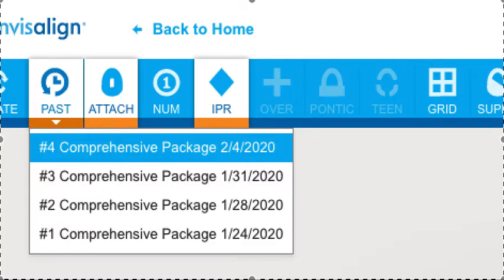Okay, so let's go back to our hypothetical 6 millimeters of crowding, 35-year-old patient. So in any case, with the class 1 canines and molars, you're probably going to have 3 options. Anyone, for me, that is, let's say, 15. This case at age 15 probably doesn't really have 3 options. I'm going to lean probably more towards expansion and proclination. I don't like to do IPR on teenagers unless it's the only option. It's not the direction I will lean. That doesn't mean I will not offer it, explain the risks, benefits, and alternatives, but it's not the way I lean.